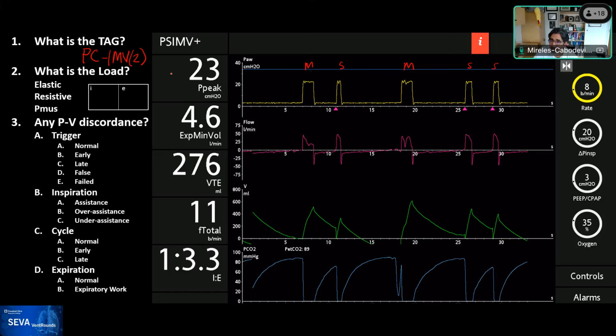That's perfect. And Leora, just by looking at the waveforms, it would be hard to see that. To my knowledge, there are currently only a couple of ventilators that do this. One of the modes is ASV or IntelliVent. Both modes do that, and the other one is mandatory minute ventilation on the Draeger ventilators. And there are other ventilators out there in the non-invasive world that also do this.